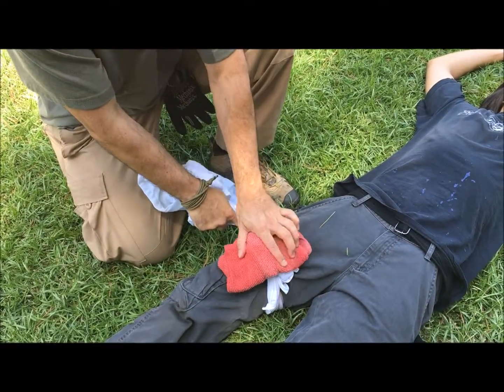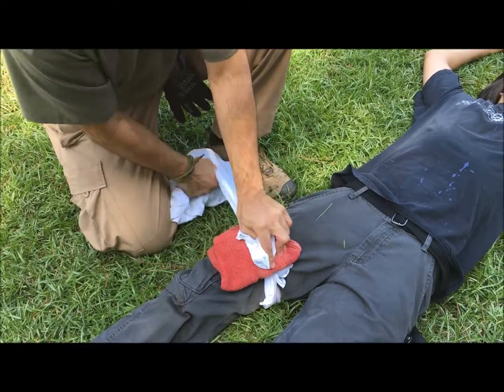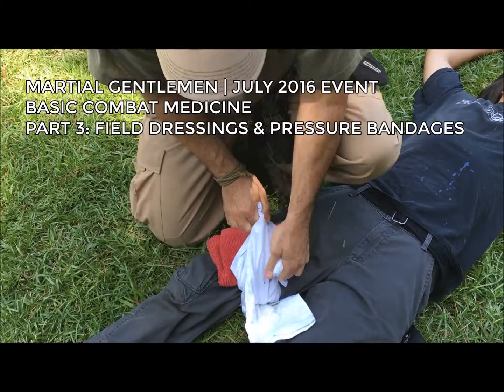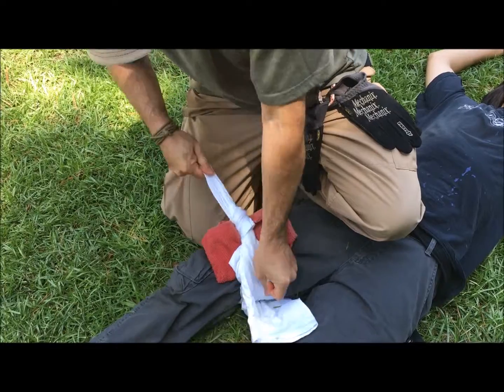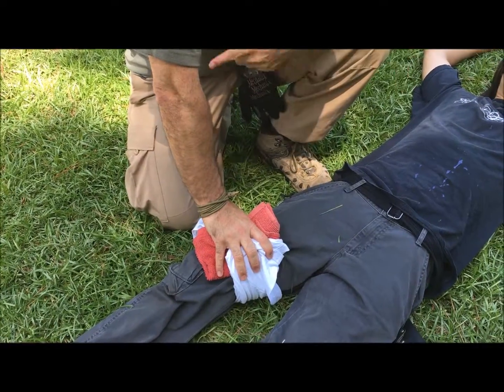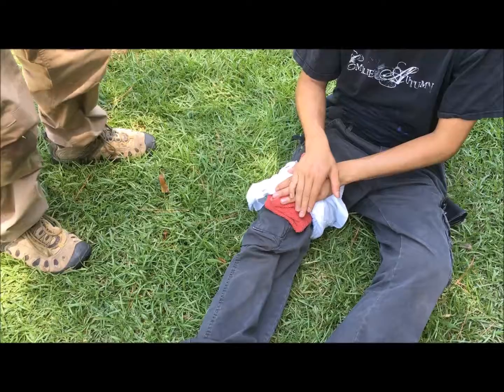So this is just a field dressing. This is going to be a pressure dressing, which is just a wad of cloth that goes on top. That is just going to get torqued down on top of this. Considering all I have is two t-shirts, that's all we're going to get. And then I'm going to have him put pressure on this if he can. If it still keeps bleeding, then he gets a tourniquet, probably. So that's pretty much it.